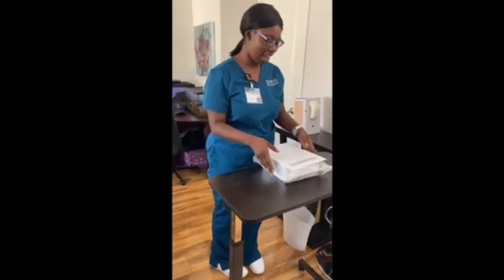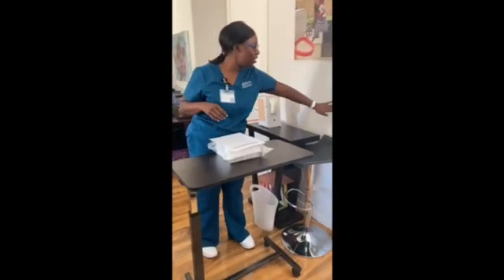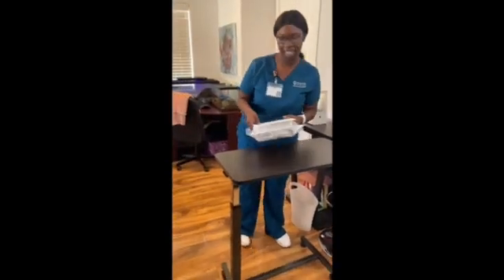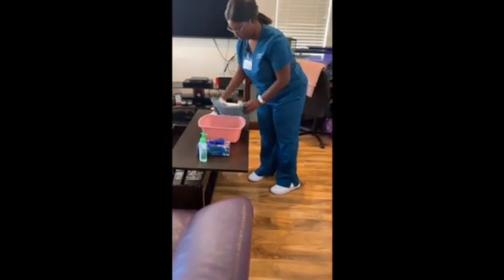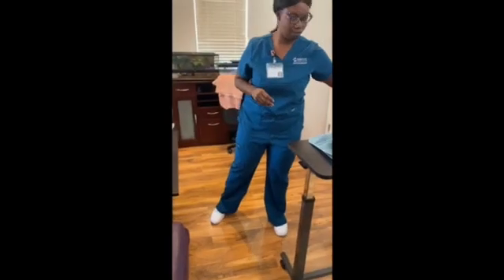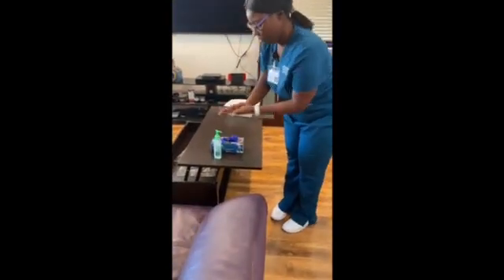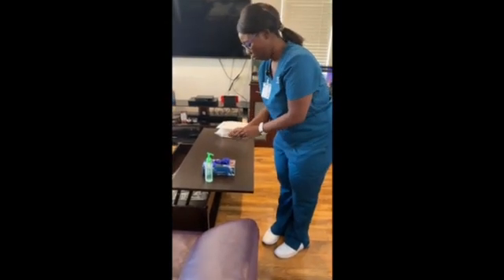All right, so I will go ahead and pull my privacy curtain, adequate lighting, and then get things ready. If help was needed, I would obtain it now. I will now perform hand hygiene and don clean gloves.